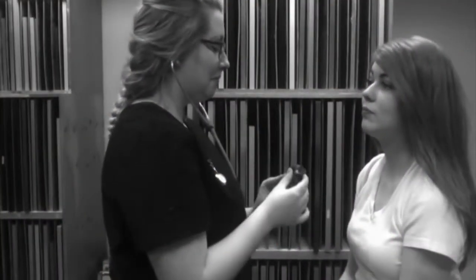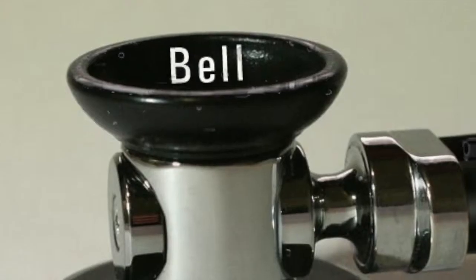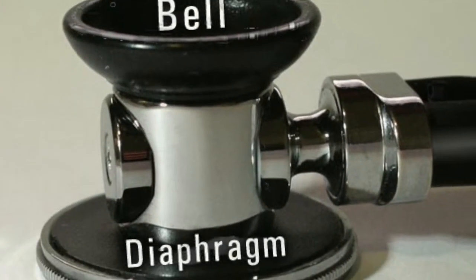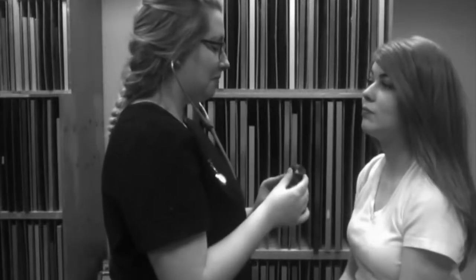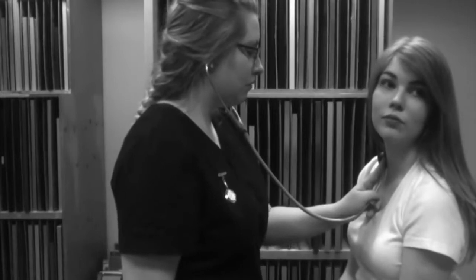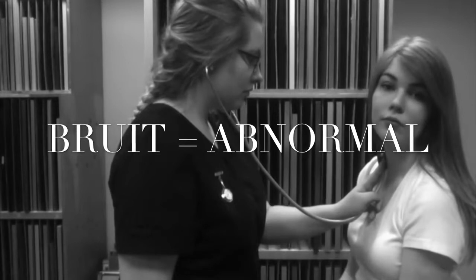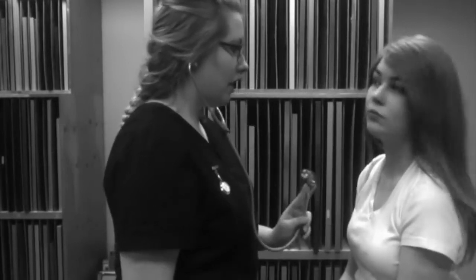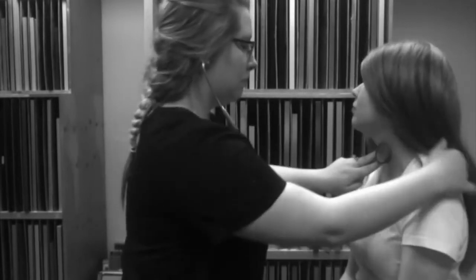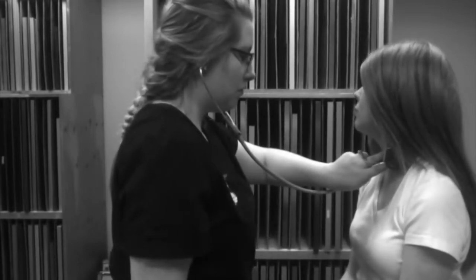The second step is to auscultate the carotid artery. Using the bell of the stethoscope, place it on the carotid artery, and what you want to hear for is the absence of a bruit. This is a blowing, swishing sound indicating blood flow turbulence, so normally none is present. There is no bruit present.